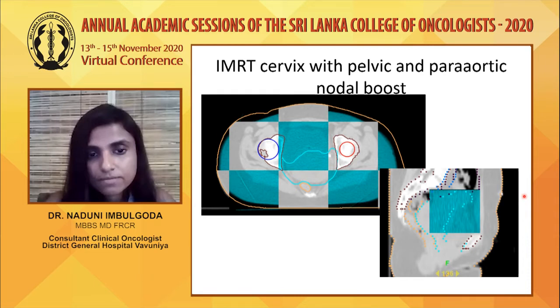The images are a bit blurry here, but that's normal for cone beam CTs, and I suggest registrars get their eyes trained by looking at frequent cone beam CTs, so that you can see beyond these blurry images of the bladder. Here you can clearly see that the bladder is underfilled, and the uterus has moved forward.